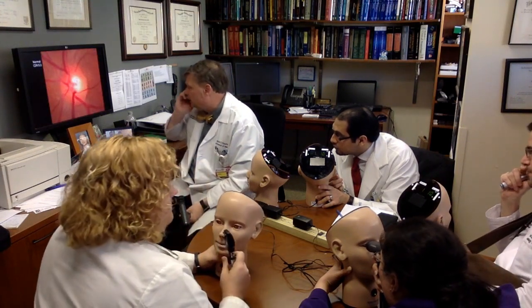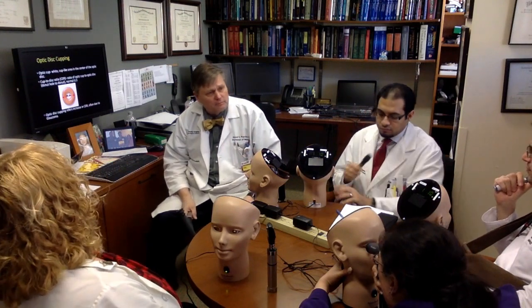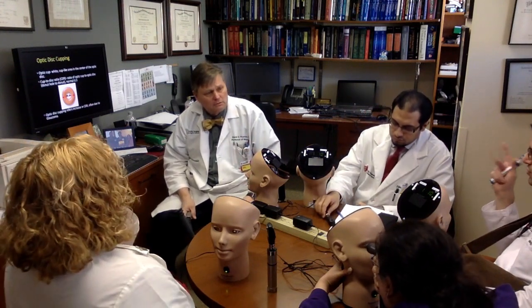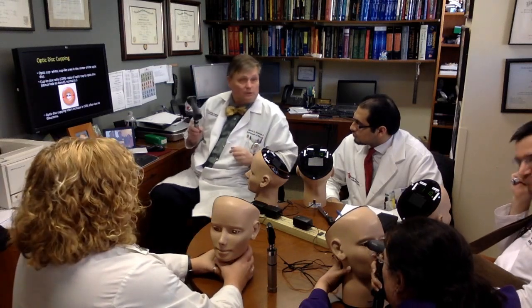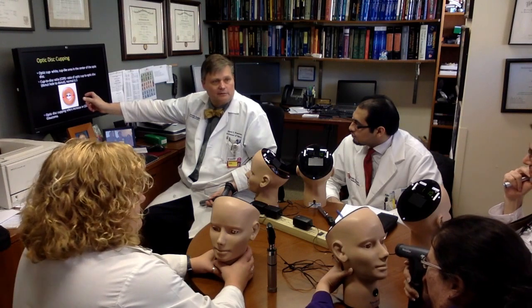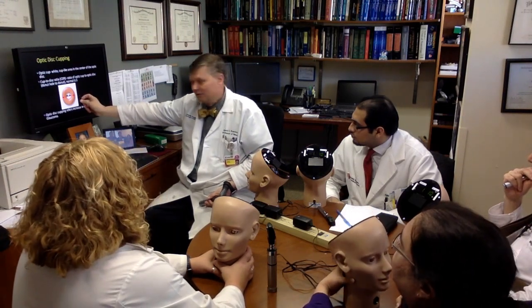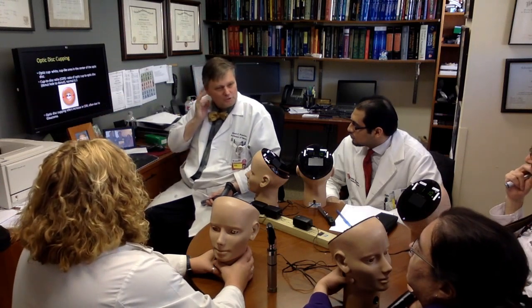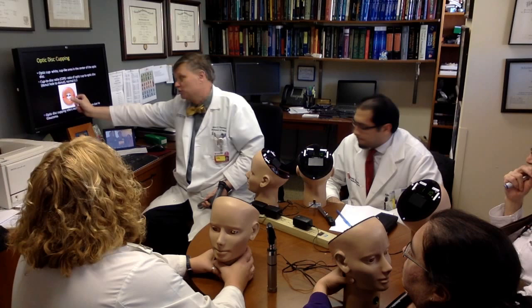Now, why is glaucoma an incredibly important thing to recognize? The most common treatable cause of blindness. Exactly. So it's the most common cause of preventable blindness. So you think about your disc being your donut, and here's the hole in the donut. The hole is where the blood vessels come out. You're just going to make a gross approximation of what the ratio is of the cup to the disc.